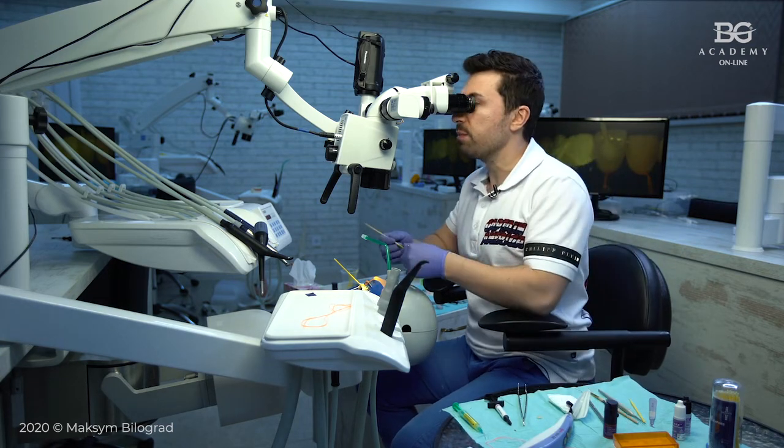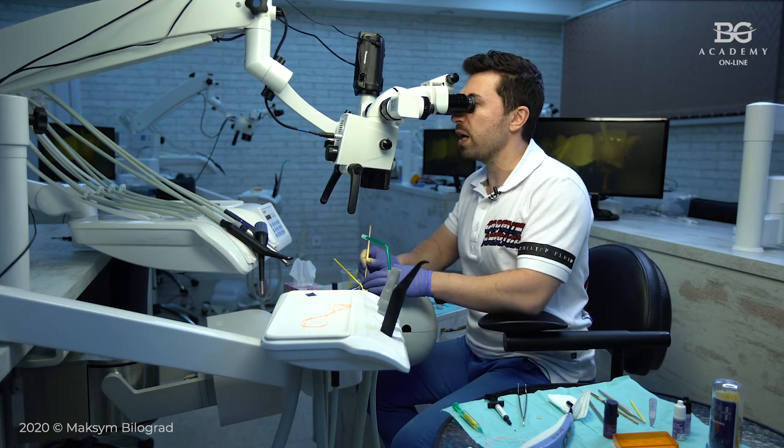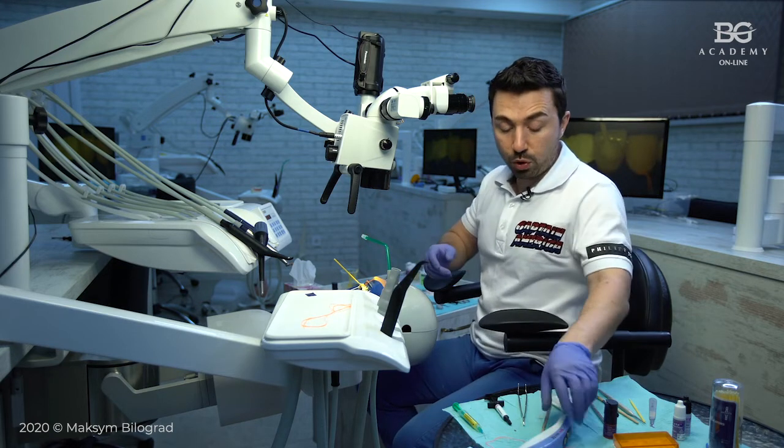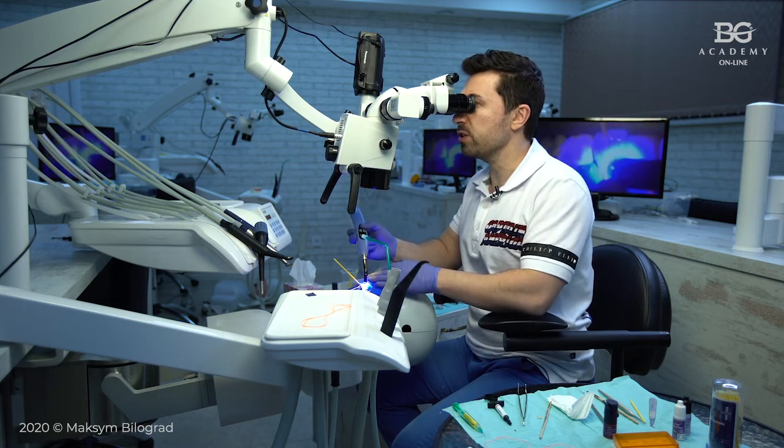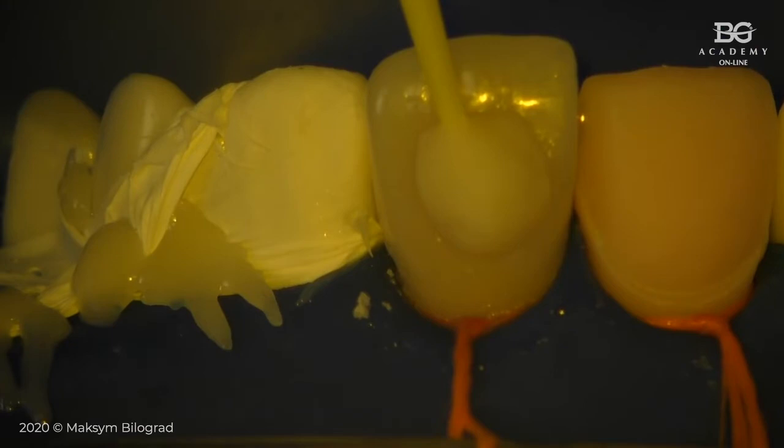I will just take my brush and spread this composite gently with a brush like this. Then I will light cure this area for just 5 seconds. Then I will remove this holder.